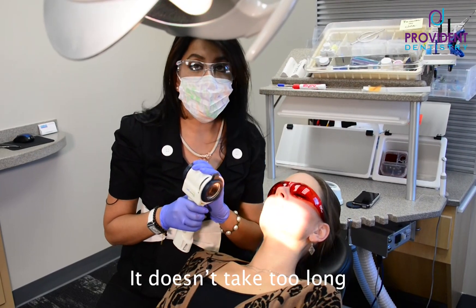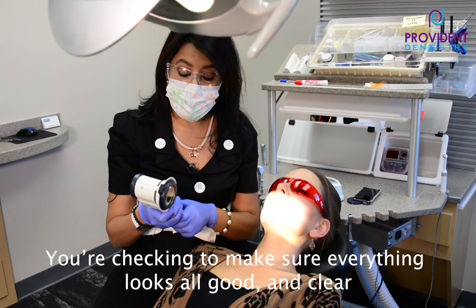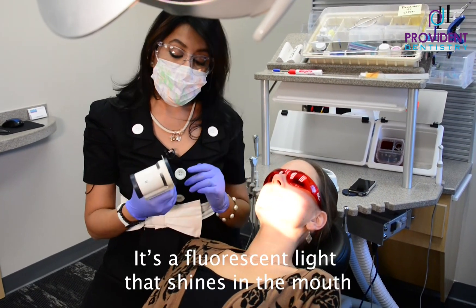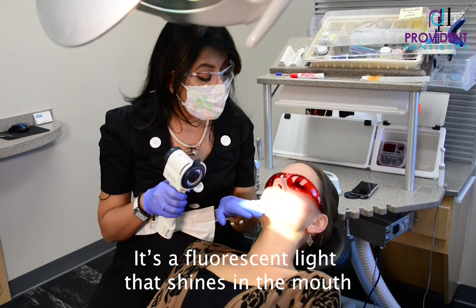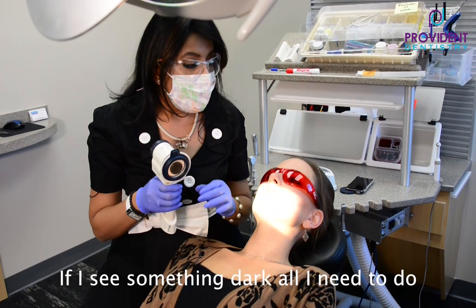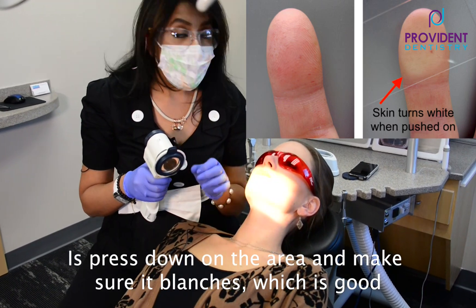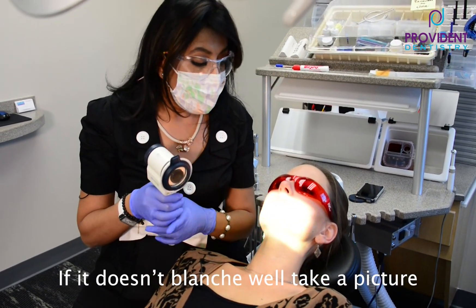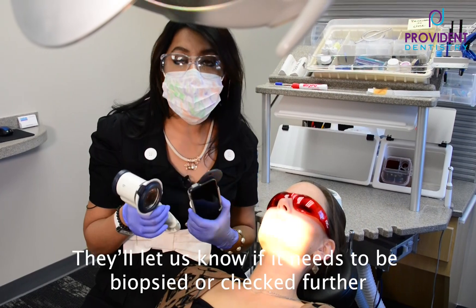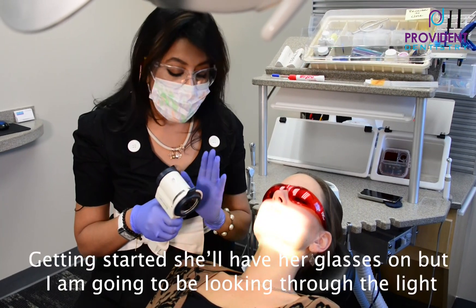Now we're going to start with the Velscope. It doesn't take too long. It is $10 a year, which is worth every penny because you're checking everything and making sure everything looks good and clear. It's a fluorescent light that shines in the mouth — it penetrates through the tissues and can show us any abnormalities. If I see something dark, I press the area to make sure that it blanches. Blanching is good news. If it doesn't blanch, we take a picture and send it to an oral surgeon, who lets us know whether it needs to be biopsied or checked further.